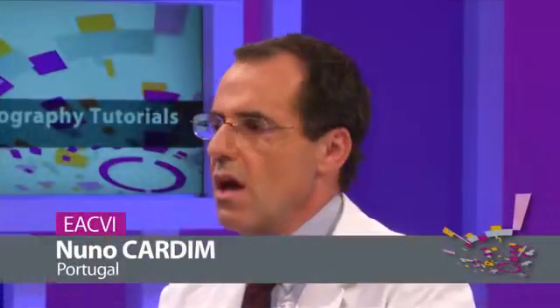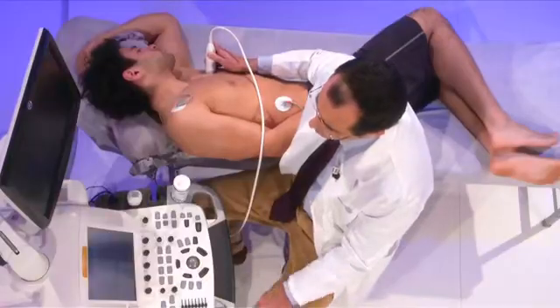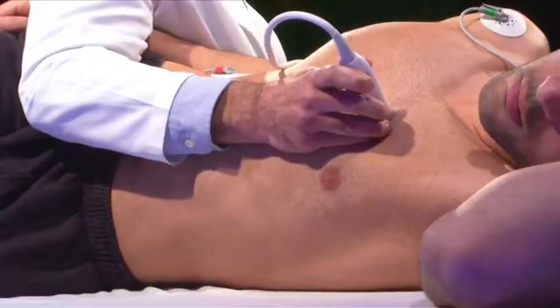What we are going to do today is to learn how to perform an echo in a hypertrophic cardiomyopathy patient. We are going to try to do it in a step-by-step approach in a clinical integrated way.